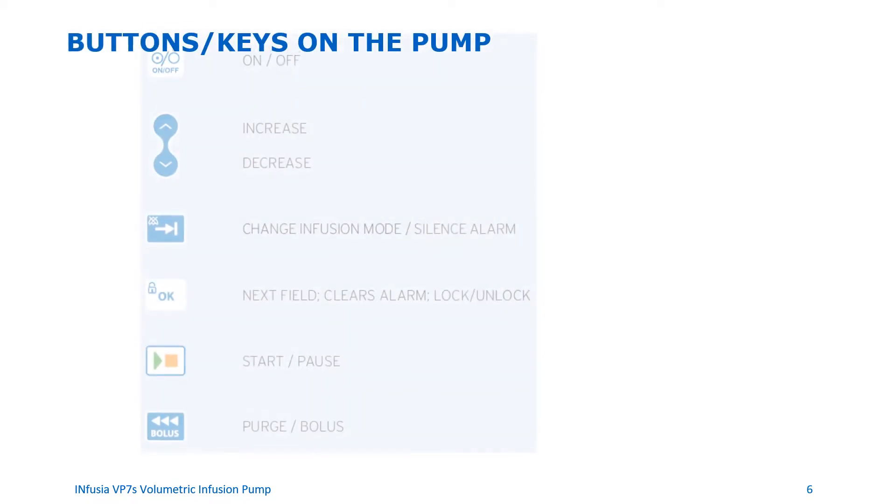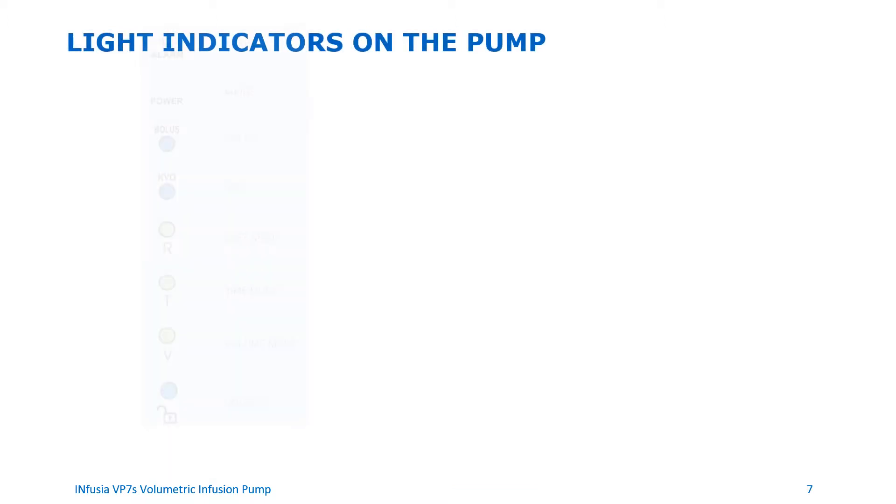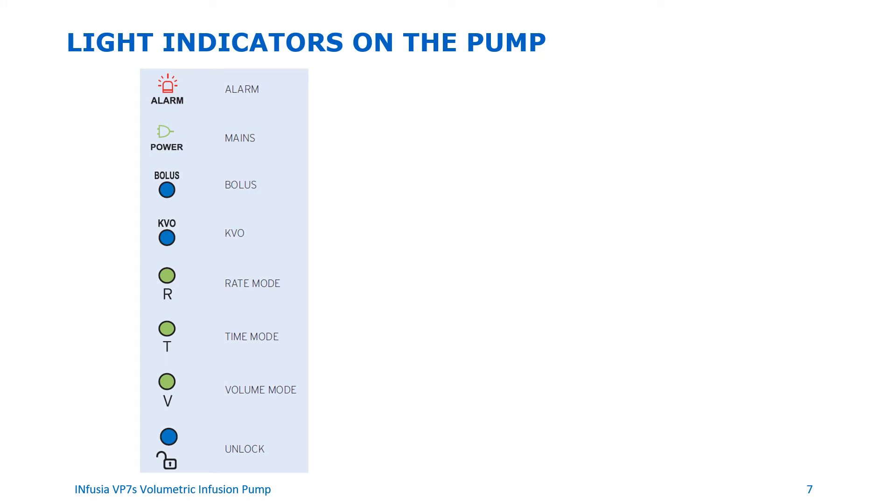Here are the buttons or keys on the pump: on/off, increase/decrease, switch button to change infusion mode or silence alarm, OK button to accept the setting or go to the next field, clear an alarm and lock/unlock the device, start/pause the device, and bolus/purge button. The light indicators on the pump include: alarm indicator, main power, bolus, KVO indicator, rate mode indicator, time mode, volume mode, and an unlock indicator.